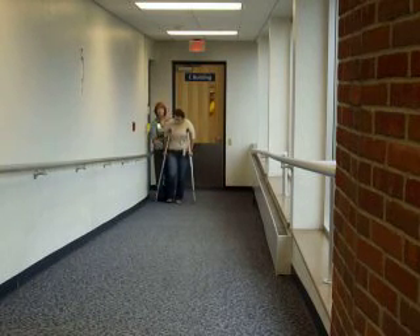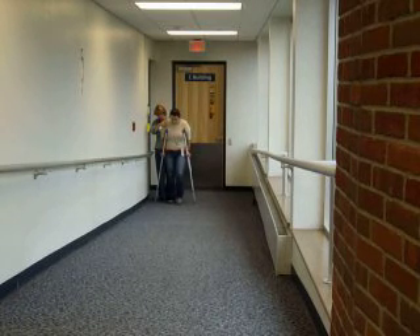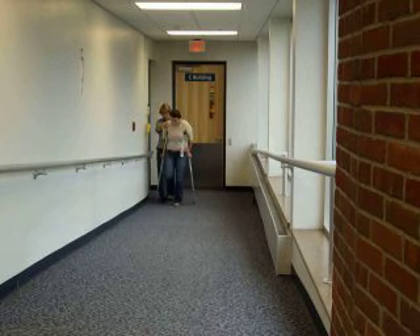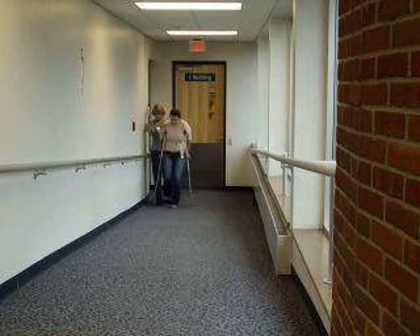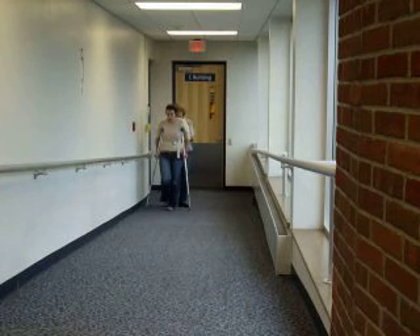Now she's at the beginning of the ramp starting to go up. We're going to treat this as the stairs — picture those squared-off stairs. No angle this time; she's just going to face straight up. She's going to bring her strong leg up first. Then bring the crutches up even with the toes. Strong leg up, then crutches even with the toes. Stop right there for a minute — I want to show something, so I'll borrow your crutches.